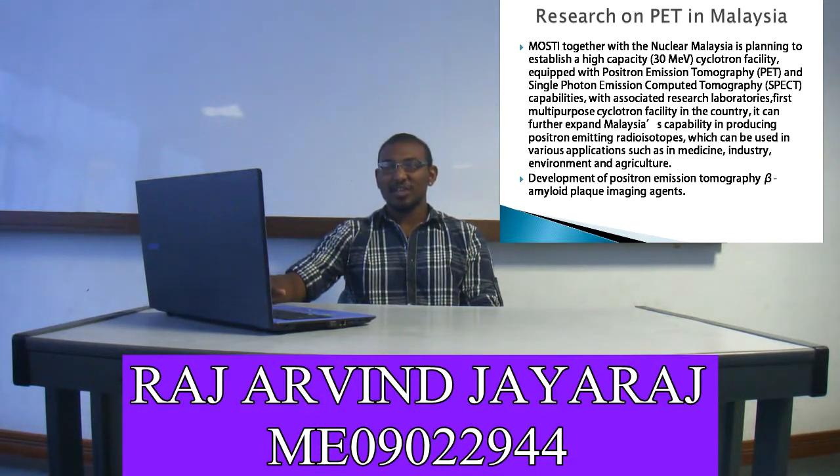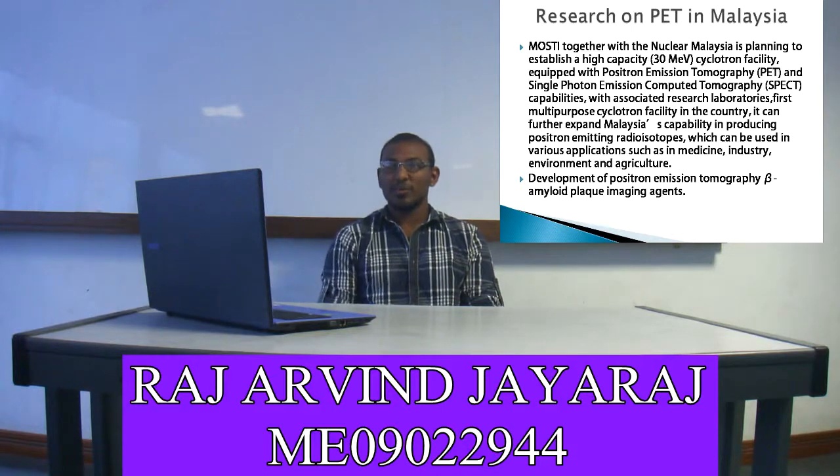Then, talking about the development of PET in Malaysia, the combined PET/CT scans provide images that pinpoint the anatomic location of abnormal metabolic activity within the body. The combined scans have been shown to provide more accurate diagnosis than the two scans performed separately. There is greater detail with a higher level of accuracy because both scans are performed at one time without the patient having to change positions, so there is less room for error.